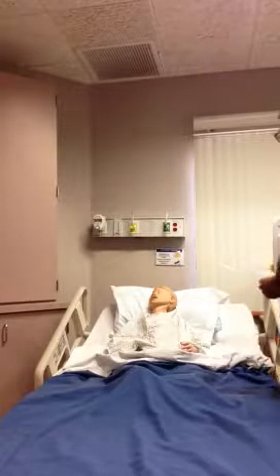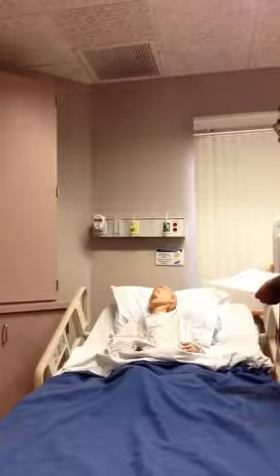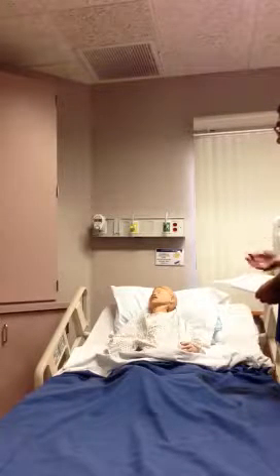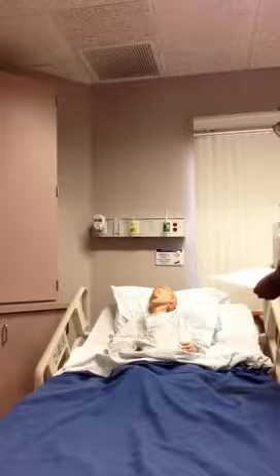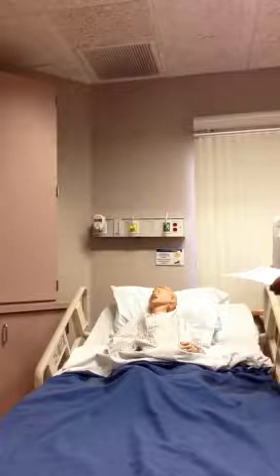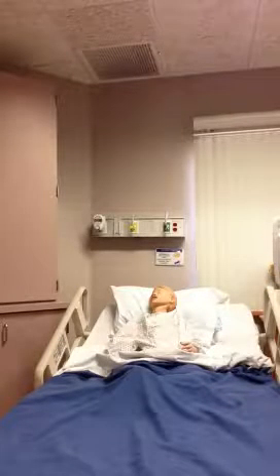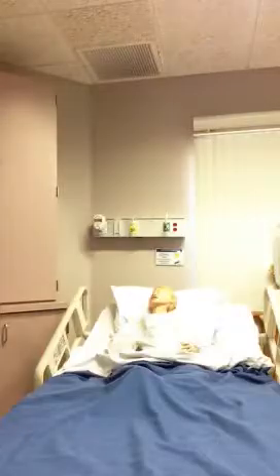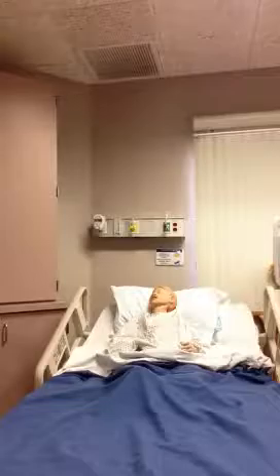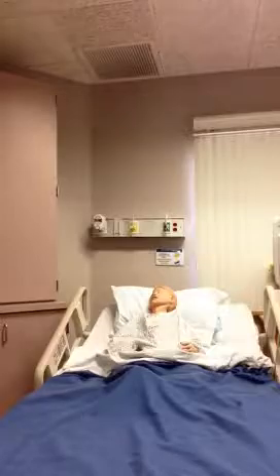Okay, so what I'd like to do is get a blood glucose level from you. That'll tell me how much sugar you have in your blood. And after I do that, I'll go prepare and bring back your insulin so that you can take your insulin before you eat. Do you have a meal ordered and prepared? Good, okay. So your meal is ordered. It will be on its way soon. Okay, well that's a good thing. We want to make sure that we're not giving you insulin and dropping your sugar too low. Let me go ahead and get some gloves on, and then I'll begin giving you a blood glucose check.